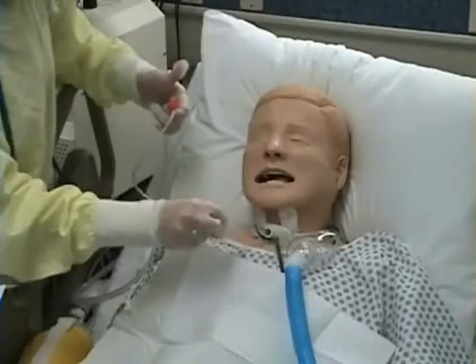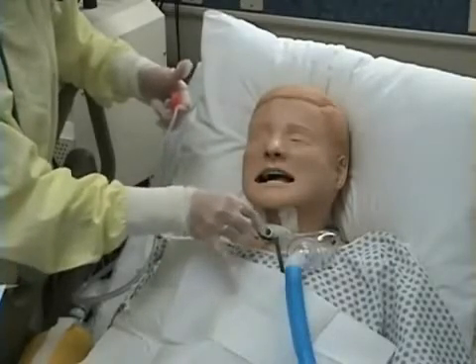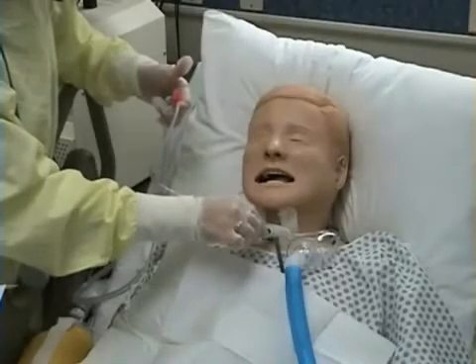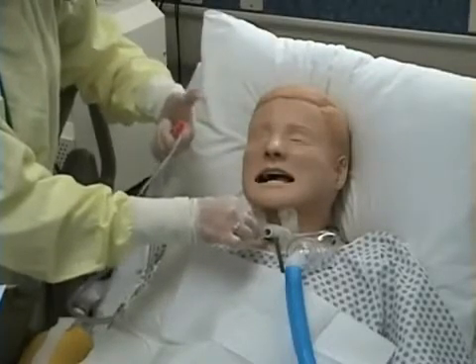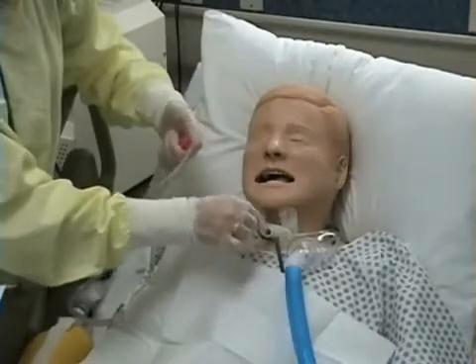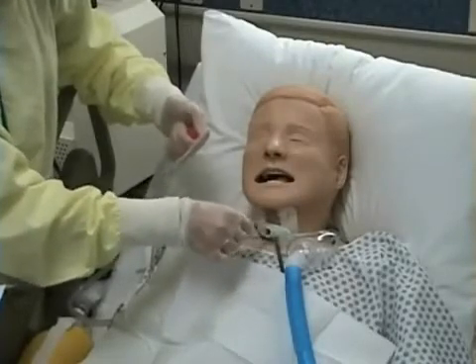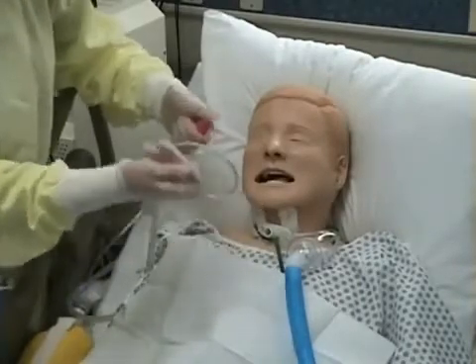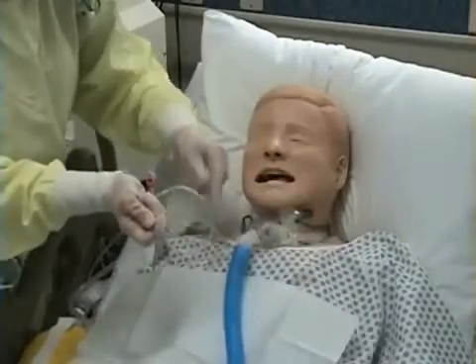I'm going to insert my catheter until I just meet resistance, and that means that I'm touching the carina. I will withdraw the catheter approximately a half inch to an inch, and then apply suction intermittently with my non-dominant hand. I want to monitor my patient, how they're tolerating this, how their oxygenation is, and looking at my suction catheter, noting the type and the amount of secretions. Then with my non-dominant hand, I will put my trach collar back.